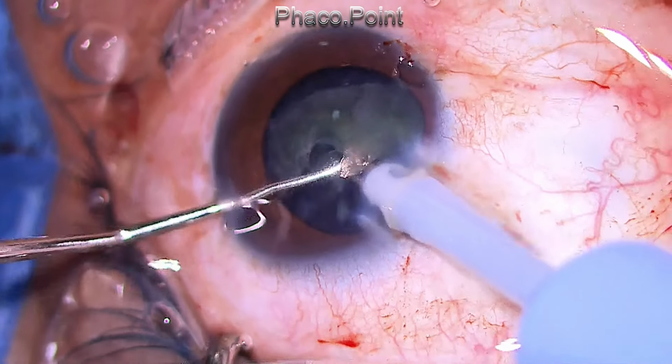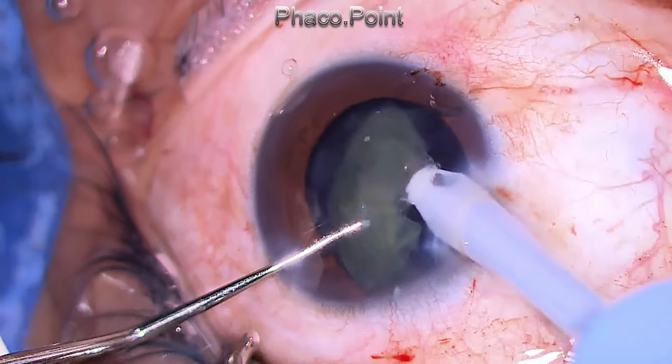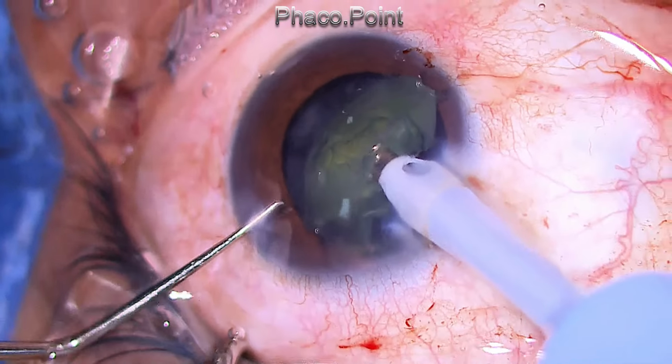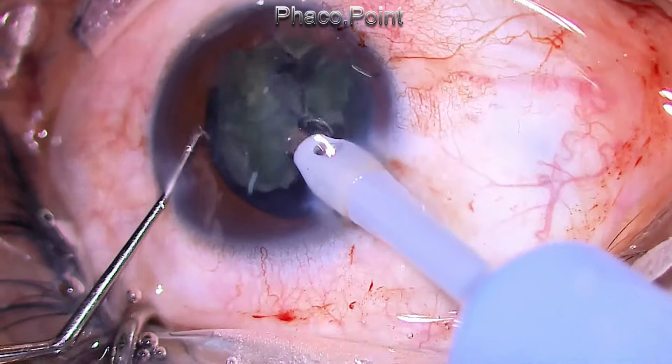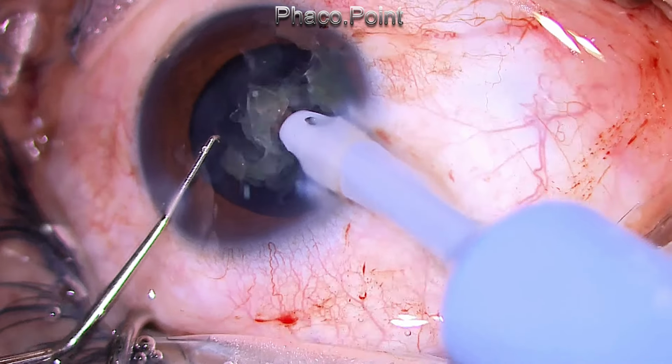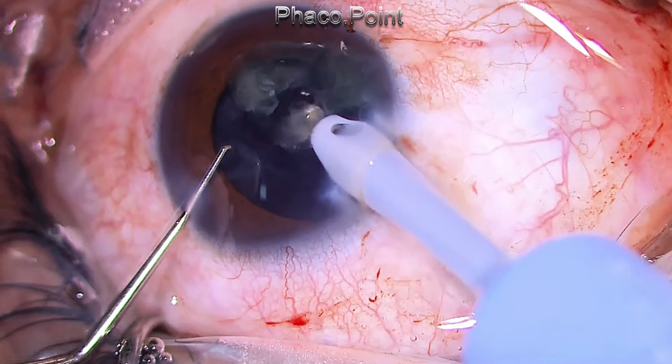The second of my great learnings from this case was, remember that even though you're operating similar cases, you can have different outcomes each and every time. This is what makes surgery really challenging and beautiful. And you need to be prepared to quickly adapt your surgical technique depending on what outcomes you experience on the table.